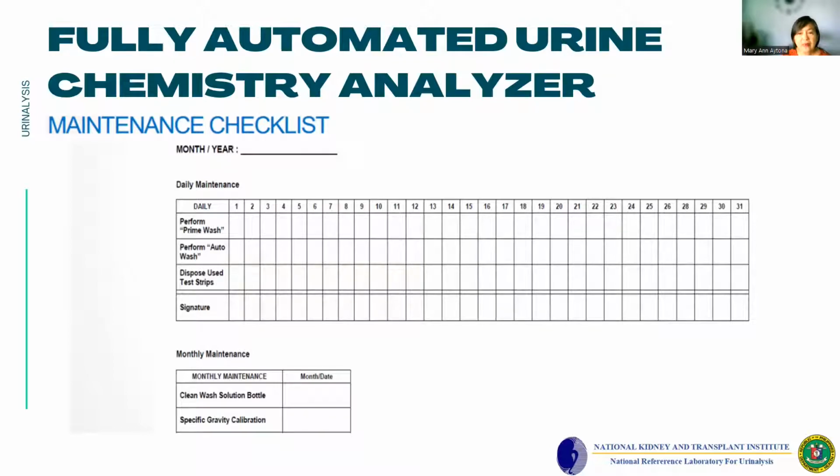Daily maintenance helps to keep systems in good operating condition and prevent large-scale equipment failure. Specifically, routine maintenance refers to simple maintenance tasks that don't require specialized equipment or in-depth skill. Consequently, this term refers to tasks that can be done by staff outside of the maintenance department.